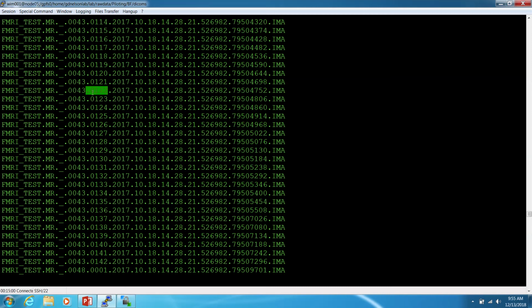Then this next one is the volume number, or sometimes we think about this as TRs. That's not totally accurate, but basically each round through the brain gets an individual number for this.